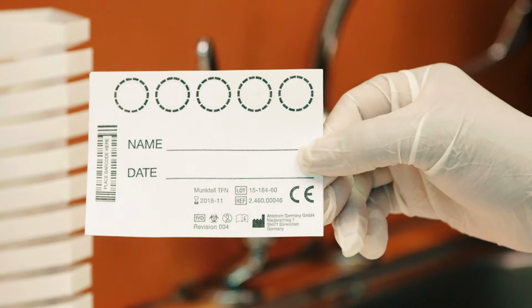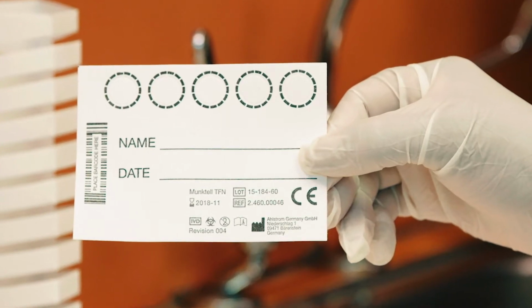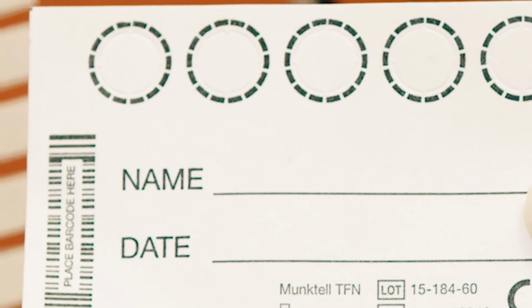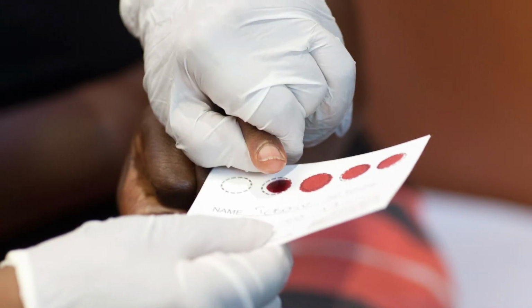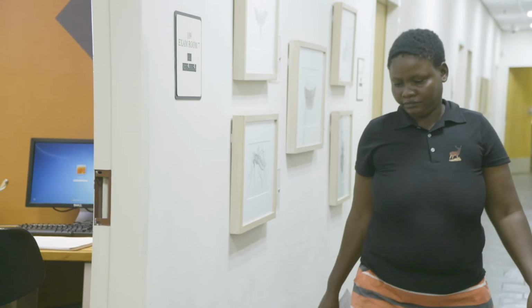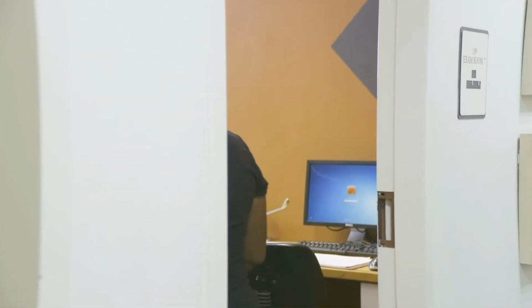To take a DBS sample, it is important to use cards made of absorbent filter paper that are specifically made for blood collection. The area where the blood needs to be collected may be demarcated by a perforated or marked circle. You will need to be sure the blood drops are centered in the circle and that the circle is completely filled. Now we will see how to take blood samples for DBS collections. Watch as this nurse prepares to collect the sample.